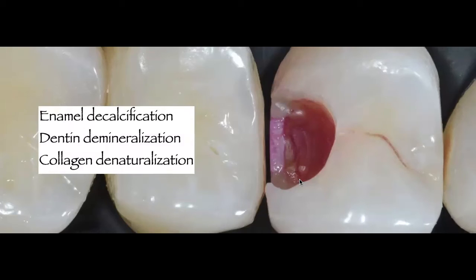The inner caries dentin is going to stain a little bit more pink instead of red. So you remove the red and you want to have some pink left behind if you are very deep or close to the pulp. If your patient is a young patient, you know that you're going to have a larger pulp chamber. You know that if you see pink, you want to stop, because again, you do not want to get into the pulp. You want to try to prevent exposing any pulp horn or the pulp chamber.